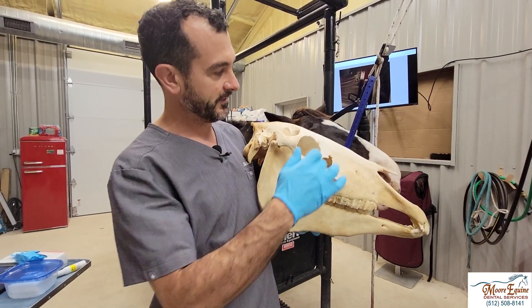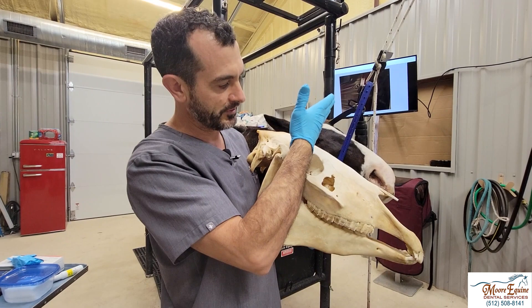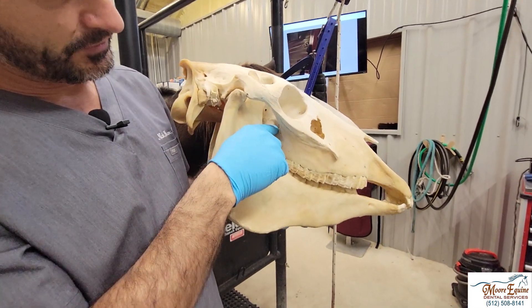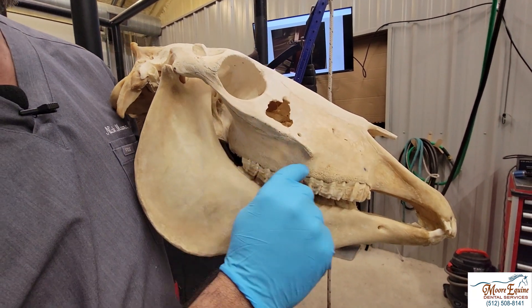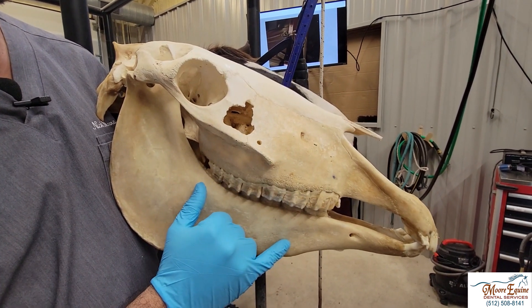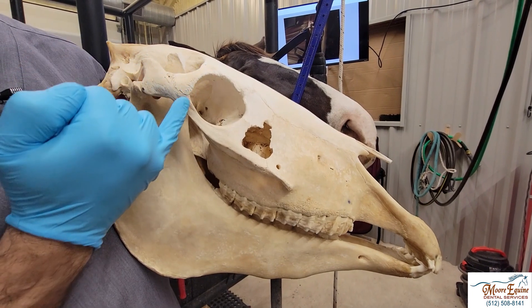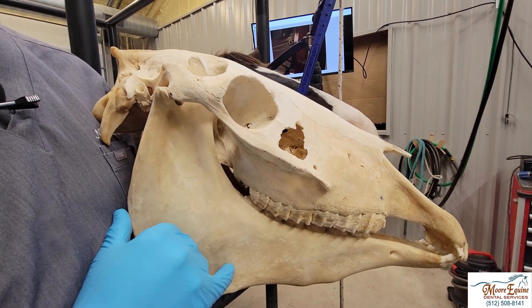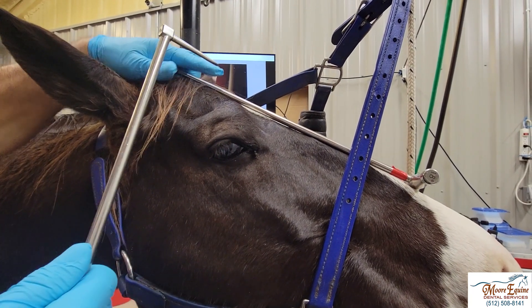The landmarks here are the frontal bone and the nasal bone. We're going to draw a line through there, then draw another line perpendicular — 90 degrees — through the lateral canthus of the eye. The needle needs to go down into the maxillary fossa, where the maxillary nerve enters the infraorbital canal and eventually exits at the infraorbital foramen. We go perpendicular to the frontal-nasal bone line at the lateral canthus, slightly below the facial crest, all the way in to the maxillary nerve.